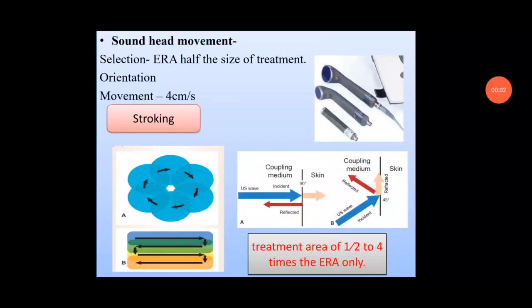In case you are planning to apply ultrasound under water, place the area in a container of water. Then you give the ultrasound. Keep the ultrasound sound head 1 centimeter away and give the treatment. Then ultrasound head movement. First of all, selecting the ultrasound head is very important. You should always select the ultrasound head which is half the size of the treatment area.